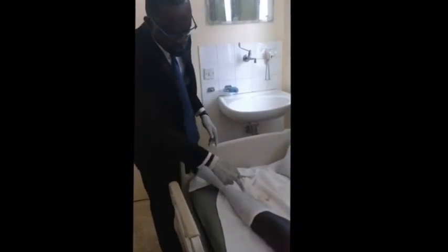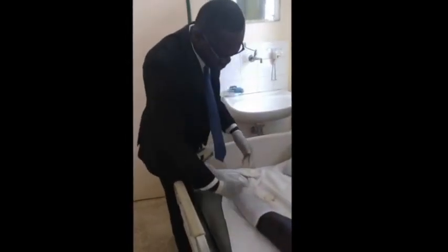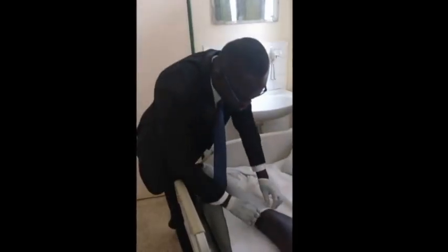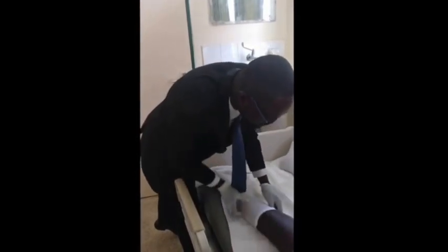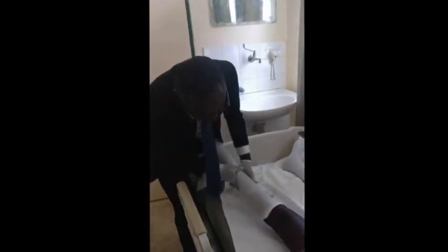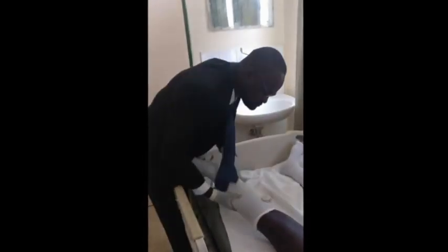So if we leave it this way, it could cause some tourniquet effects. That will decrease blood supply to the distal part of the limb and cause ischemia. So we need to go ahead and run it over just to make sure we don't have any tourniquet effects.